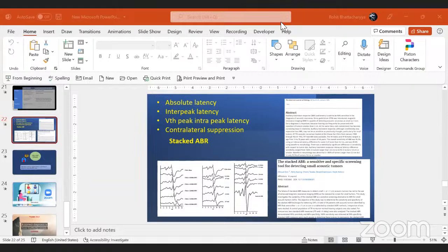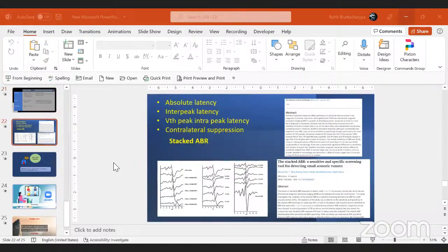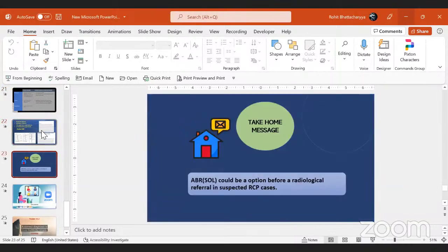If you find that SDS is such and your pure tone threshold is 50. Yeah. But we have to show the different size of the tumor by the imaging. I love the imaging, sir. That's why the hearing threshold and speech discrimination score are very much important. If it is a slow-growing tumor, you can wait also. Yeah, sir. But you have to think of the possibility of morbidity also: facial palsy and cosmetic deformation. There are many things, actually difficult to say.